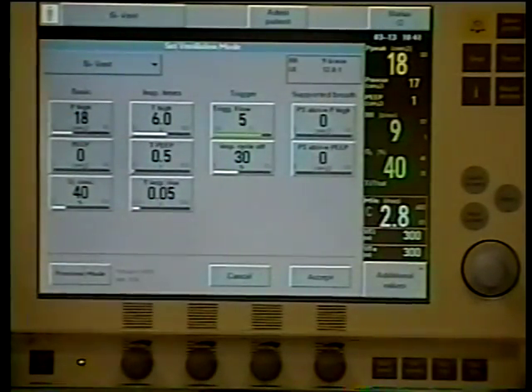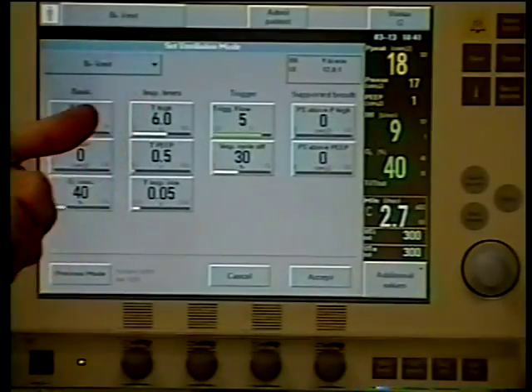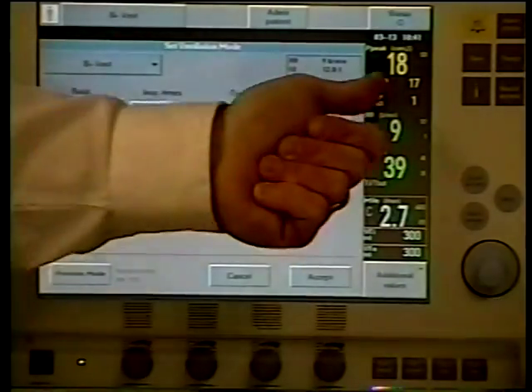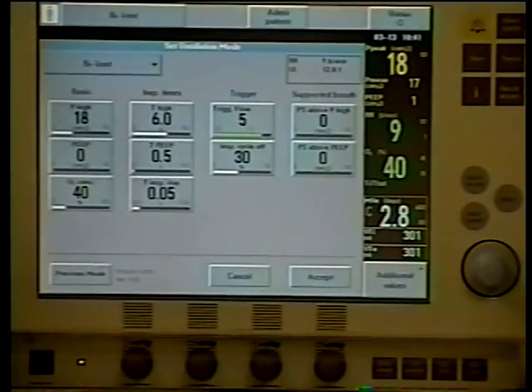And let's face it, if you have a patient who's not spontaneously breathing, but you know they're doing great from the oxygen side, don't stretch, just drop. Just start dropping the P high, give the patient some mean airway pressure. If you're still having a little problem with the PaCO2, don't stretch at that particular point. That's okay, because the goal right at the moment is just trying to drop that P high down to get your mean airway pressure to an acceptable value that you can go to more conventional ventilation.